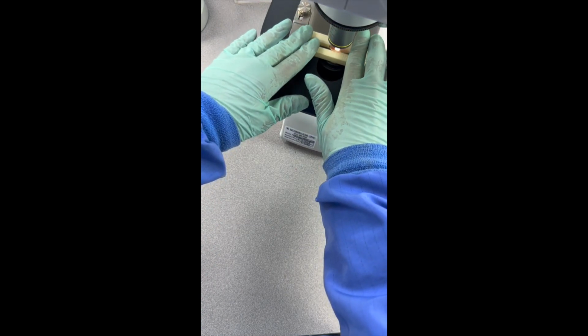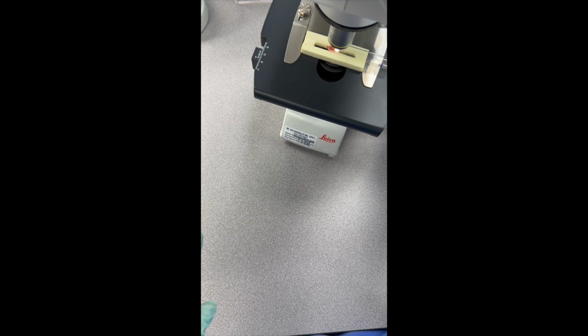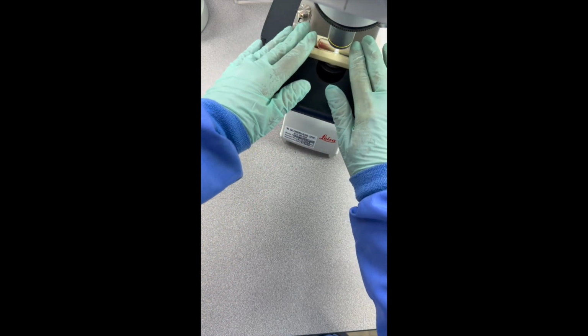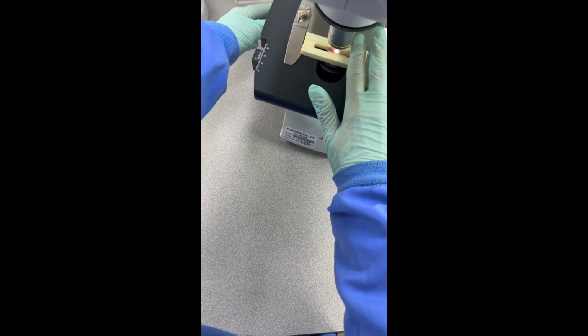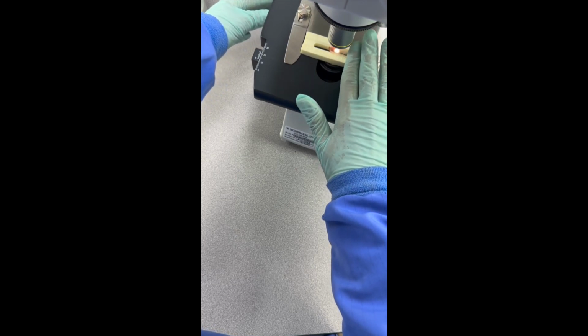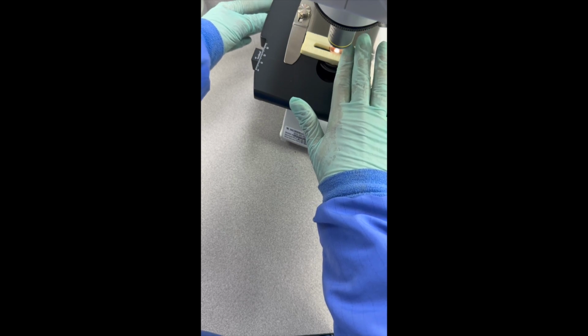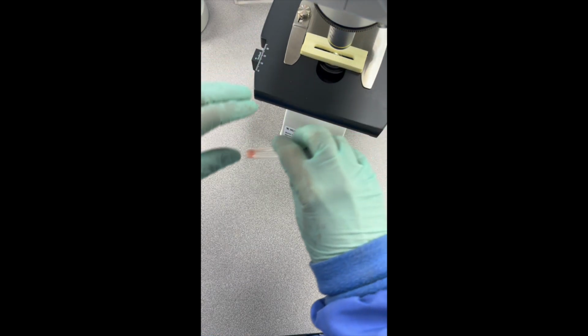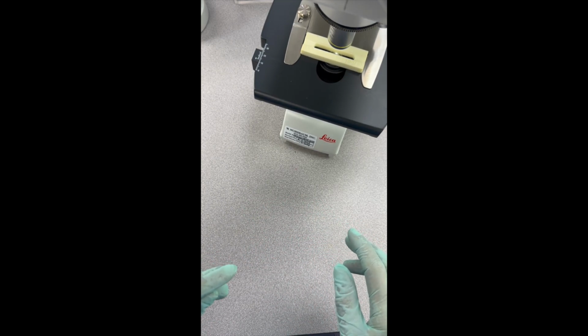And then we want to focus. Now, as we're focusing this, we also want to be rotating it. So while it's on there, we want to be looking at it, focusing it, and actually rotating that tube so we can view those cells flowing freely in that suspension through our microscope. And then we would look at our negative, our positive, and then our patient. And what I'm going to do is put this on the recording microscope and record those images so you can see what they all look like.